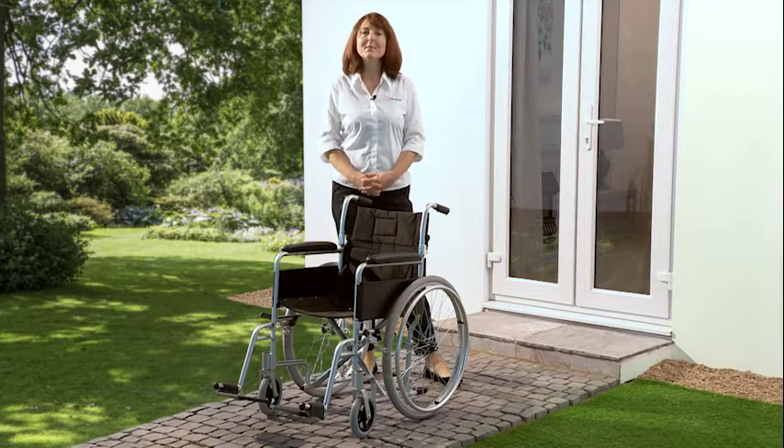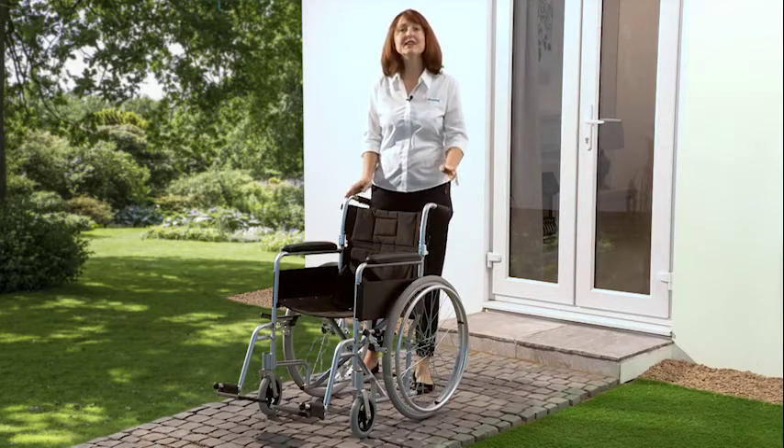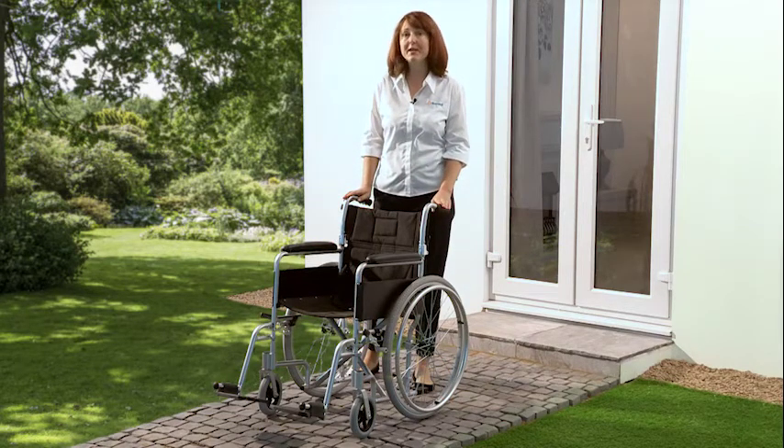Hi and welcome to LiveWell. My name is Laura and I'm here today to introduce you to the Superlite Self-Propel Wheelchair.